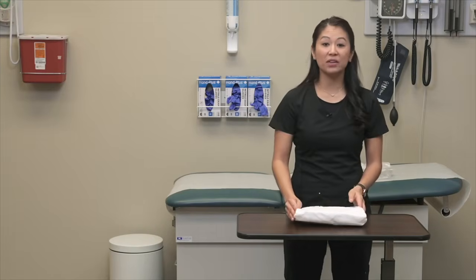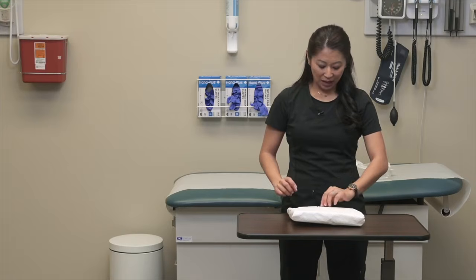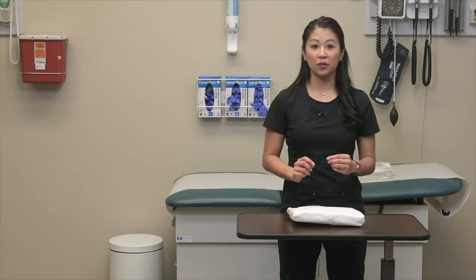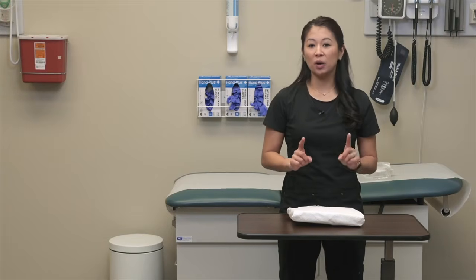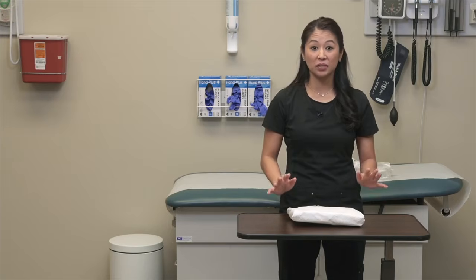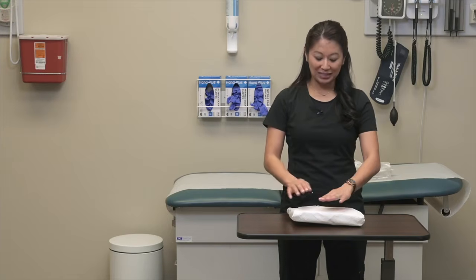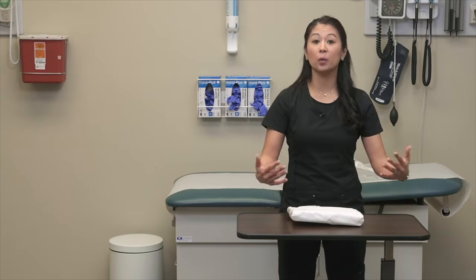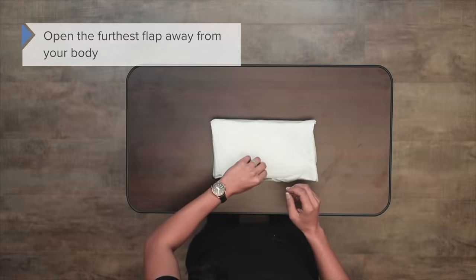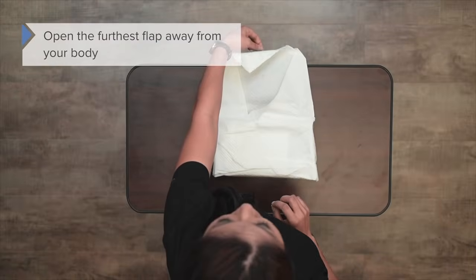All right, so once I've got my package open, I'm going to take this top flap. I'm going to grasp the outside of this and open that flap first. Now, before we get started, one thing to keep in mind, you're thinking, okay, this is a sterile item. I don't have gloves on. I'm touching the outside. Why this is acceptable is because this outside portion is what's going on the table and not used on our patient. All right, so let's look at this top flap. We're going to grasp this and open this away from our body.